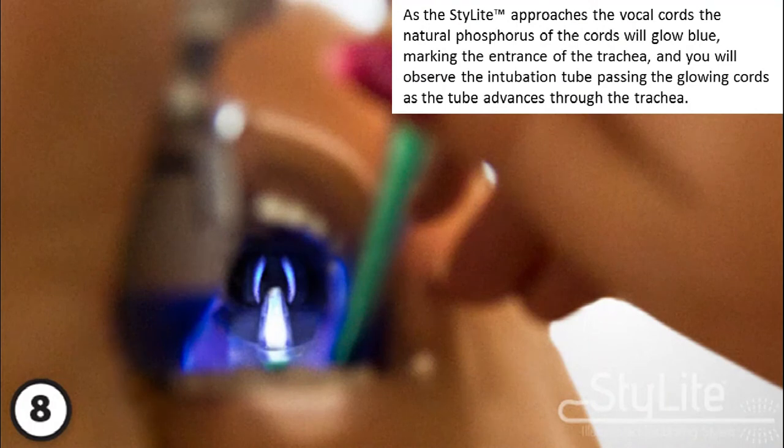As the stylet approaches the vocal cords, the natural phosphorus of the cords will glow blue, marking the entrance of the trachea. You will observe the intubation tube passing the glowing cords as the tube advances through the trachea.